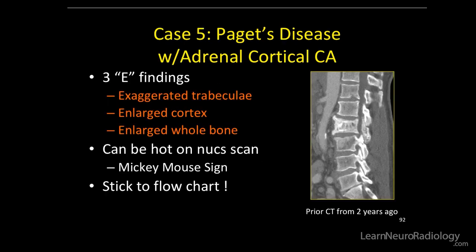It was Paget's disease, incidentally with adrenal cortical carcinoma. The three E findings of Paget's disease: exaggerated trabecular pattern, enlarged cortex, and enlarged whole bone. And don't forget, this can be hot on a nuke scan — the classic finding is the Mickey Mouse sign. Stick to the flow chart. This wasn't adrenal cortical carcinoma with metastasis as originally thought. Here's the CT from two years ago where the lesion was stable.